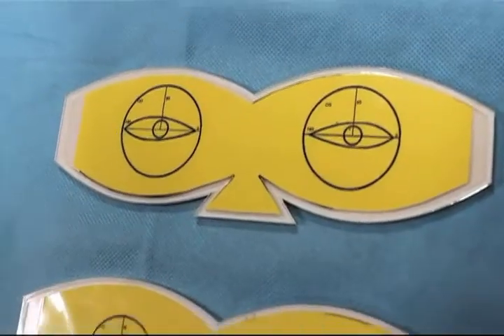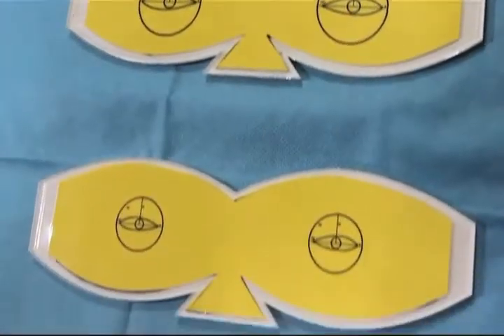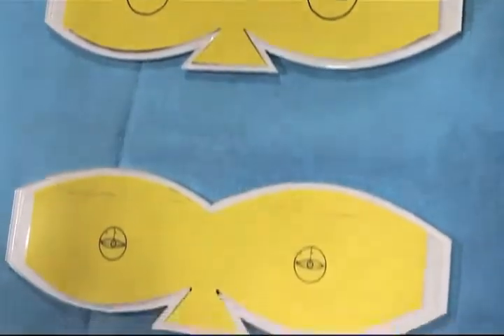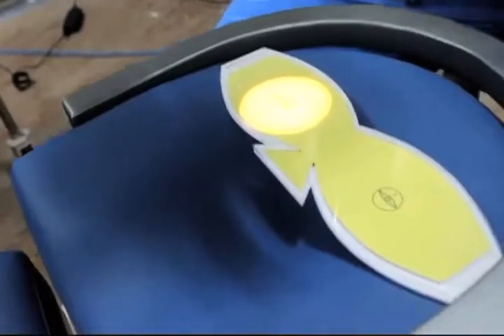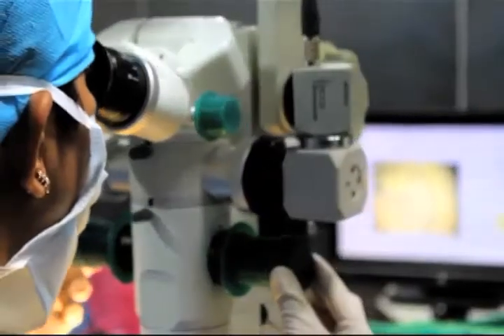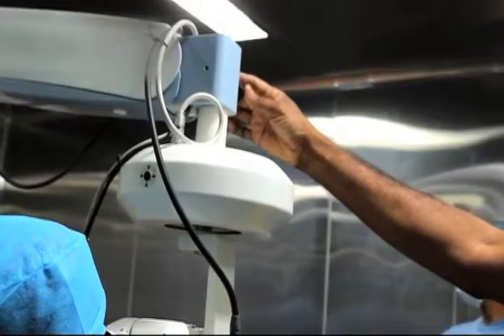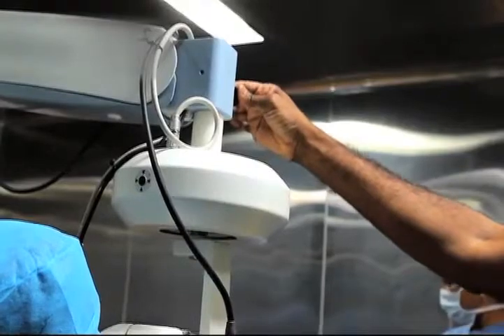To achieve a perfect orientation of the operating eye, a set of bilateral eye template tools for different magnification settings of the microscope is provided. As a first calibration step, the optical head of the microscope is fixed as decided by the surgeon to suit his own comfort zone.